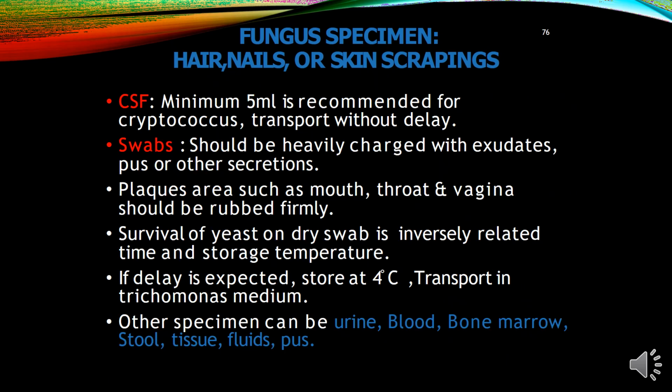In case of CSF infection, a minimum of 5 ml of sample is recommended for Cryptococcus, transported without delay. The swab should be heavily charged with exudate, pus and other specimens. Plaque areas should be rubbed firmly in areas like mouth, throat, vagina. Survival of yeast on a dry swab is inversely related to time and storage temperature. If delay is expected, store at 4 degrees, transport in Trichomonas medium.